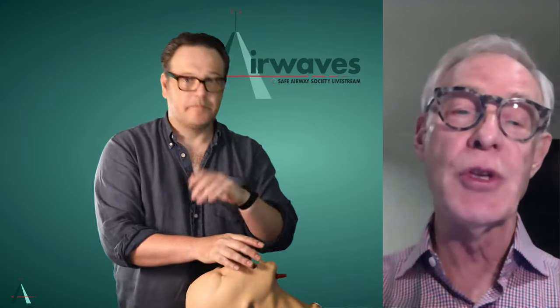It's easier to demonstrate this technique with the GlideScope because the terminal portion of the blade is flat, and the concept of trying to insert the blade so that the terminal portion is parallel with the floor is easier to demonstrate with the GlideScope than with the other blades. But the technique is the same.